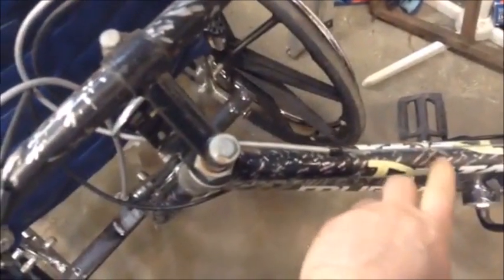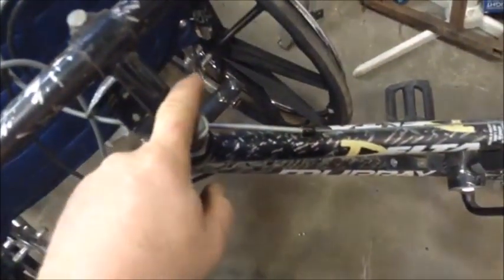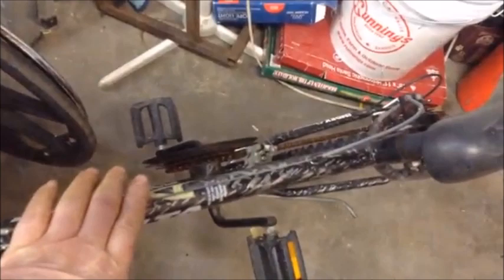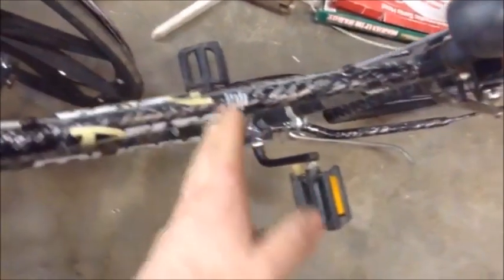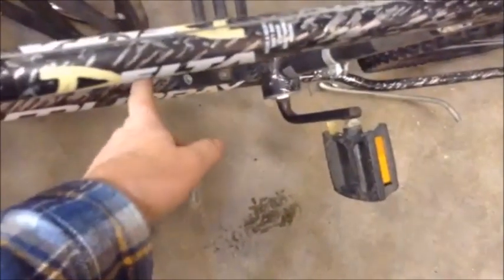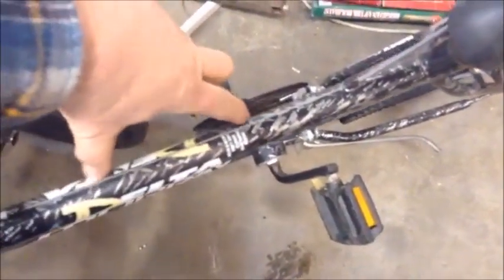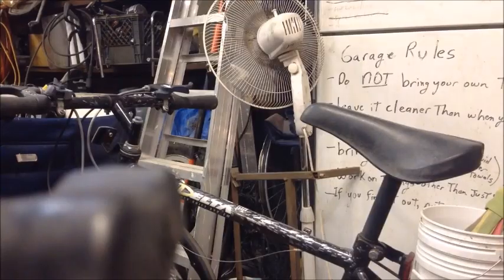And then we're going to end up adding about 4 inches of material in here so that the headstock is straight up and down in there. That's going to allow the bicycle to pivot back and forth in a swing without leaning like this. This is unrideable when it leans like this. So that's our next step. We're going to cut through here, we're going to notch here, and we're going to spread this out and add material to extend this backbone. Alright, we'll get to cutting.